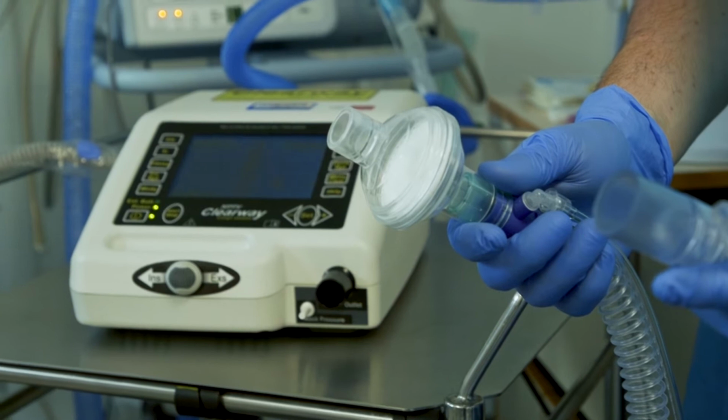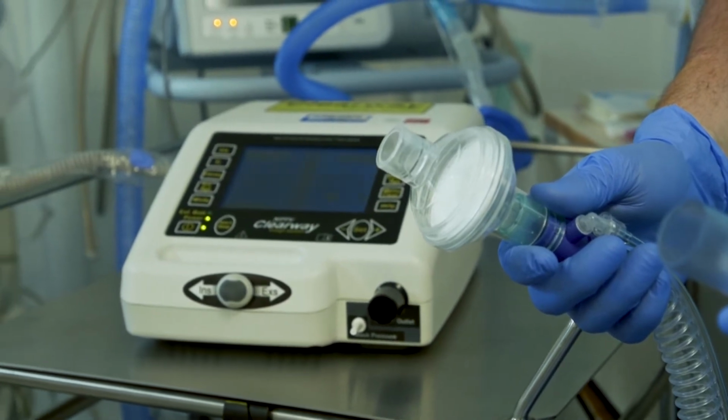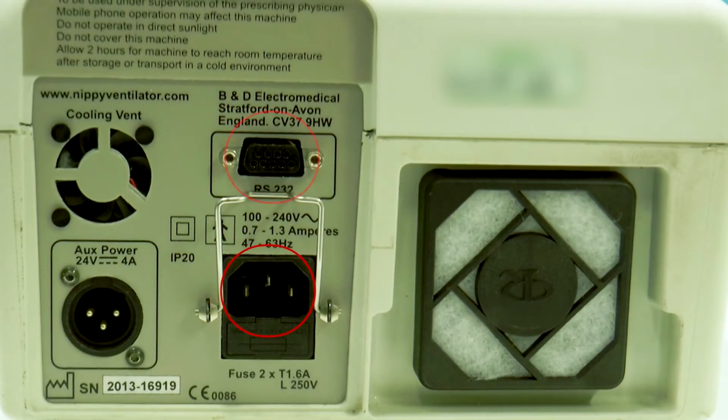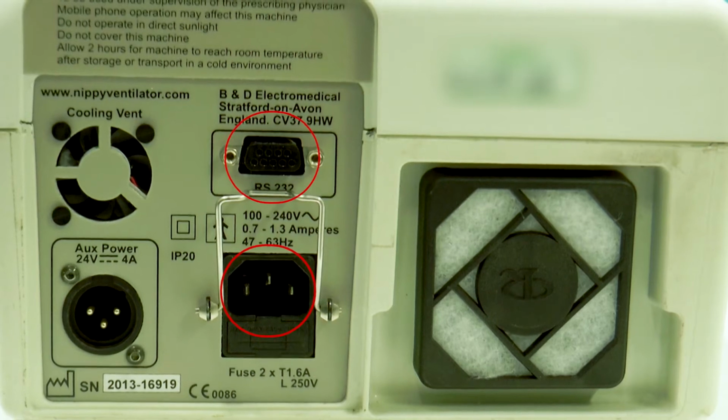The physiotherapists will set up the equipment prior to commencing the treatment with the patient. Firstly, the mechanical insufflation-exsufflation or MIE machine is set up. Here the machine has been set up on a trolley so that it can be close to the patient. The power cable and hand remote are attached to the back of the machine.